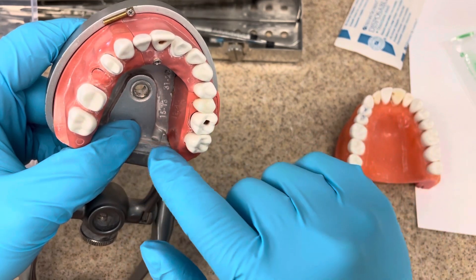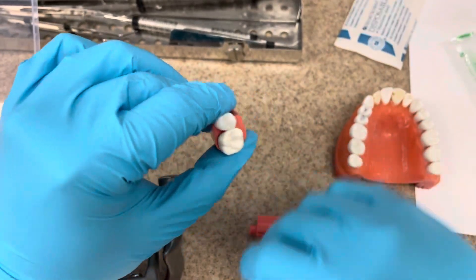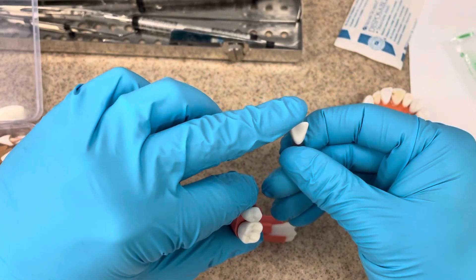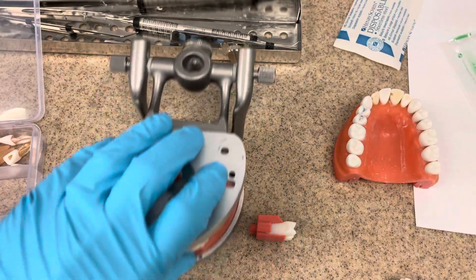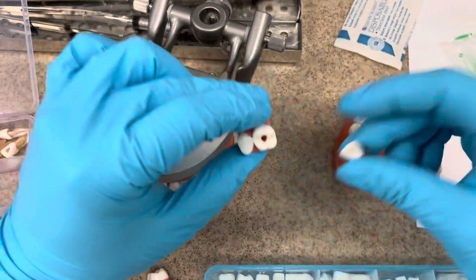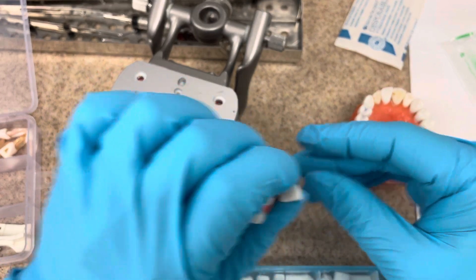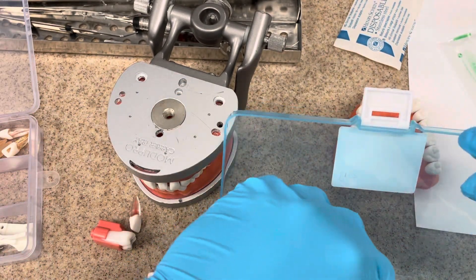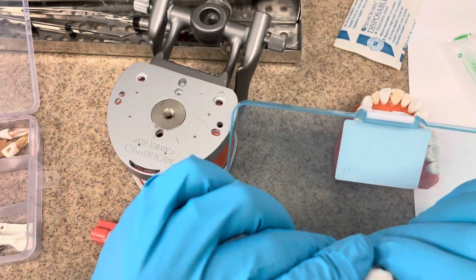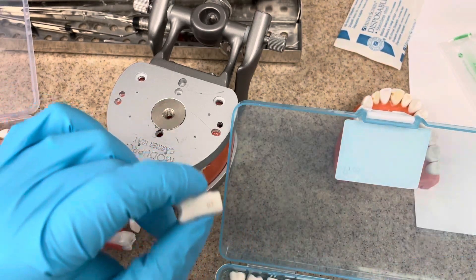When purchasing all of these things, you want to make sure you have enough teeth. For practice, a good recommendation is three to four of each. This is what the 14 endo looks like unprepped. This is what 8 endo looks like unprepped. Here is an example of PROST teeth that you can purchase. The endo pieces are much more expensive — probably around $13 to $16 each. The PROST are much cheaper, about $1.50 each. Most of the time you can get away with just buying 3, 5, and 9, but you may want to buy additional teeth on either side so that when you do nick the tooth, you can tell.